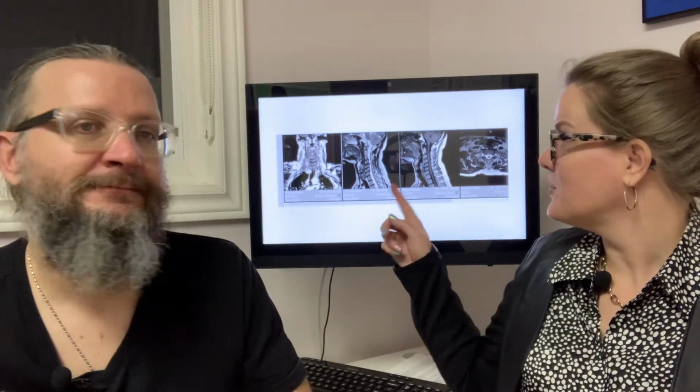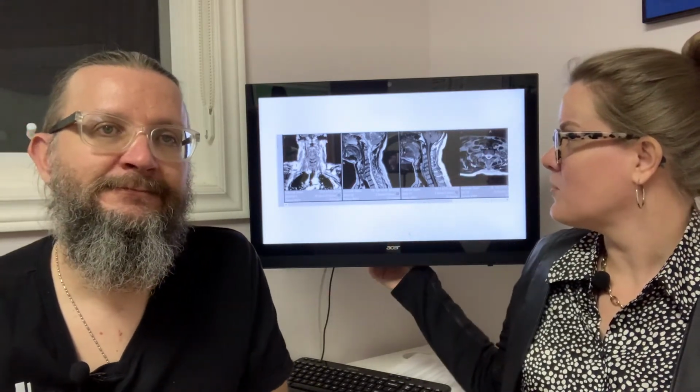Or even more significant level to be picked up on X-ray. So sensitivity does change depending on what you're looking at. Yeah, absolutely. And here we just have a few MRIs just to give you an example of what they look like, and it looks kind of weird actually.